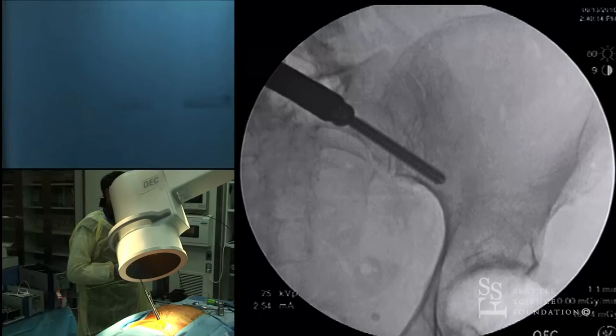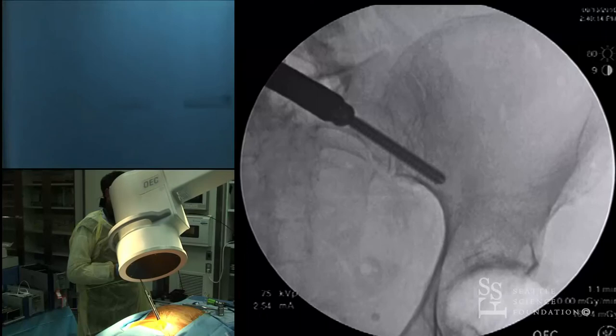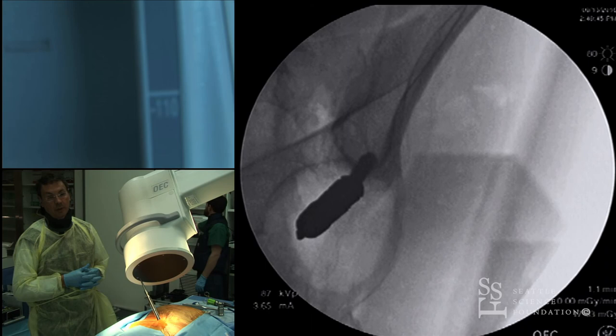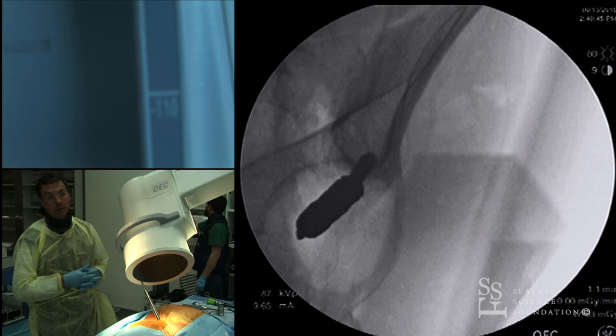Any questions from the audience? The screw is contained inside the teardrop — we just need to keep advancing and it will work from inferior to superior.